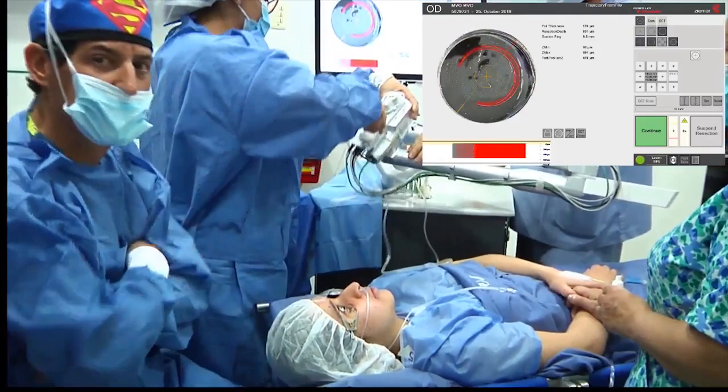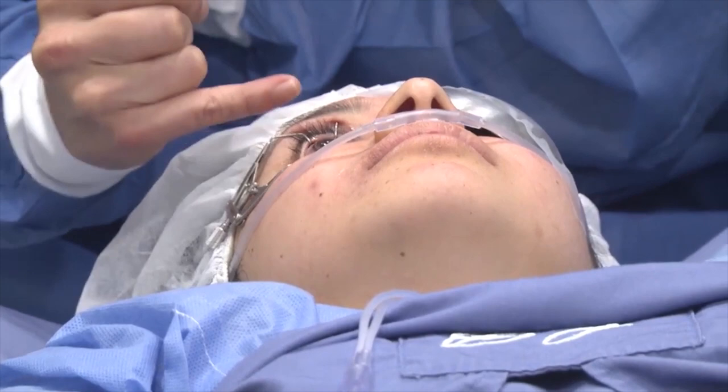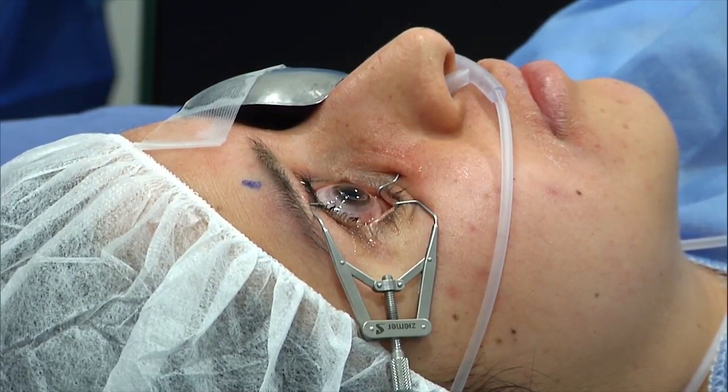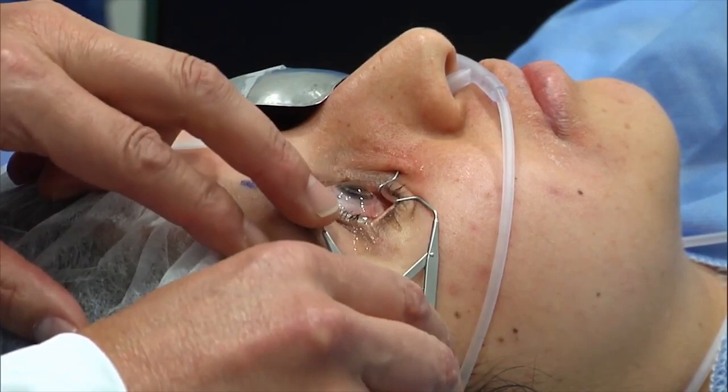Try to focus the eye. We're going to focus on the eye so you can see the resection. Obviously, we'll see it much better under the microscope. Okay. But as you can see, there's the resection in which you can basically notice what the laser did. We'll take the patient to the OR to place the sutures, do the resection, and suture the cornea.